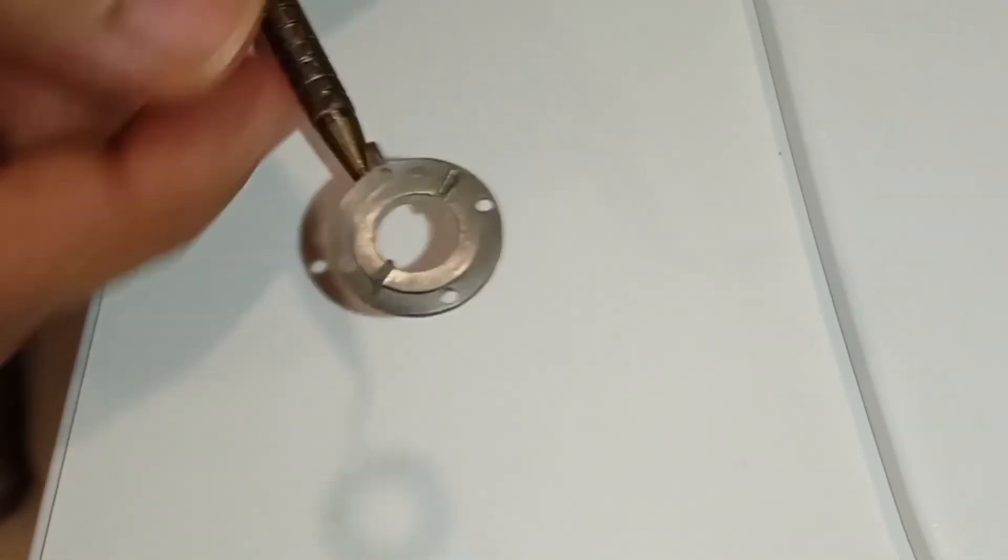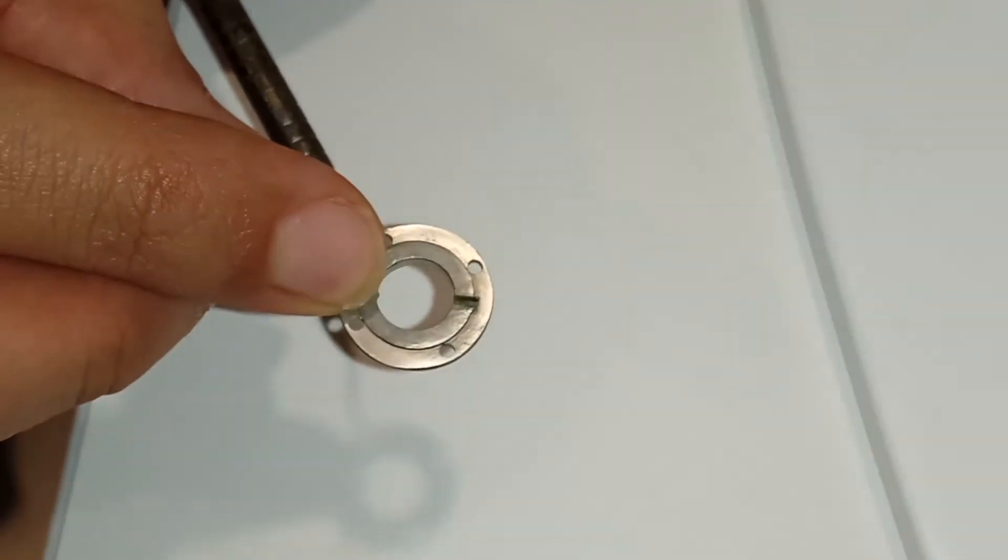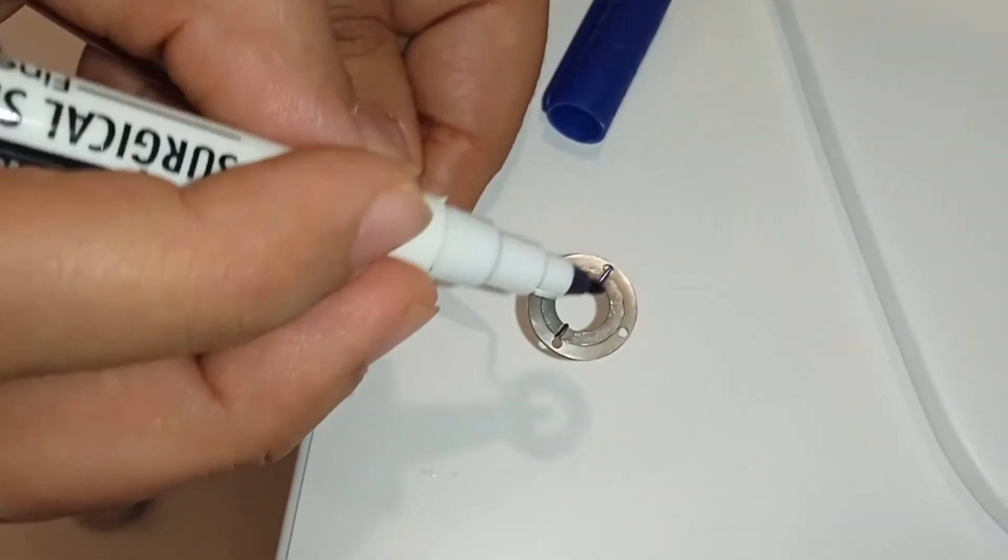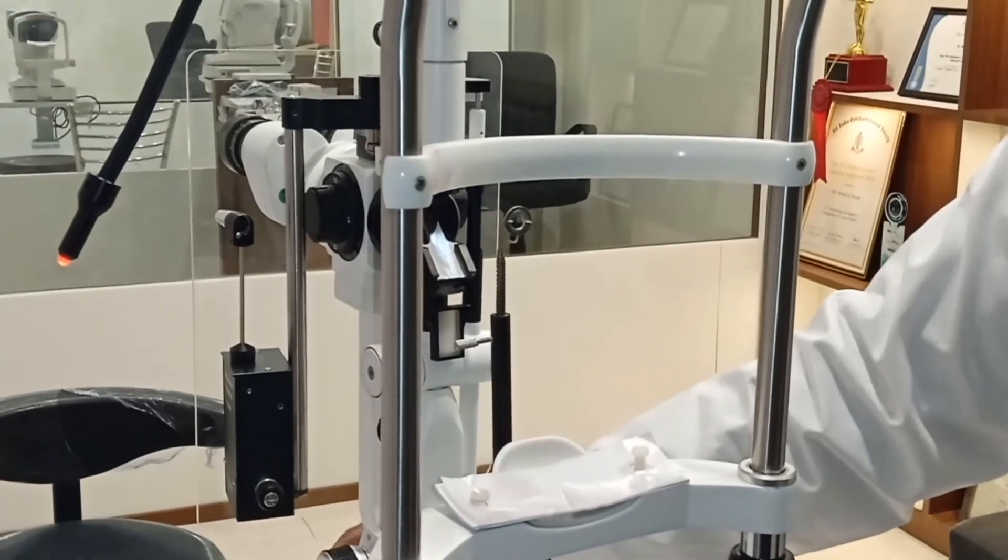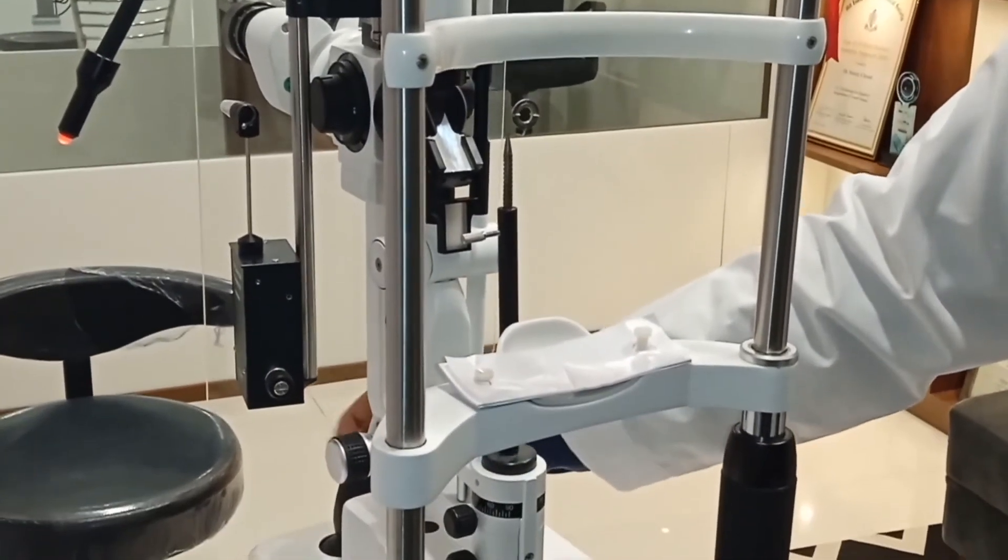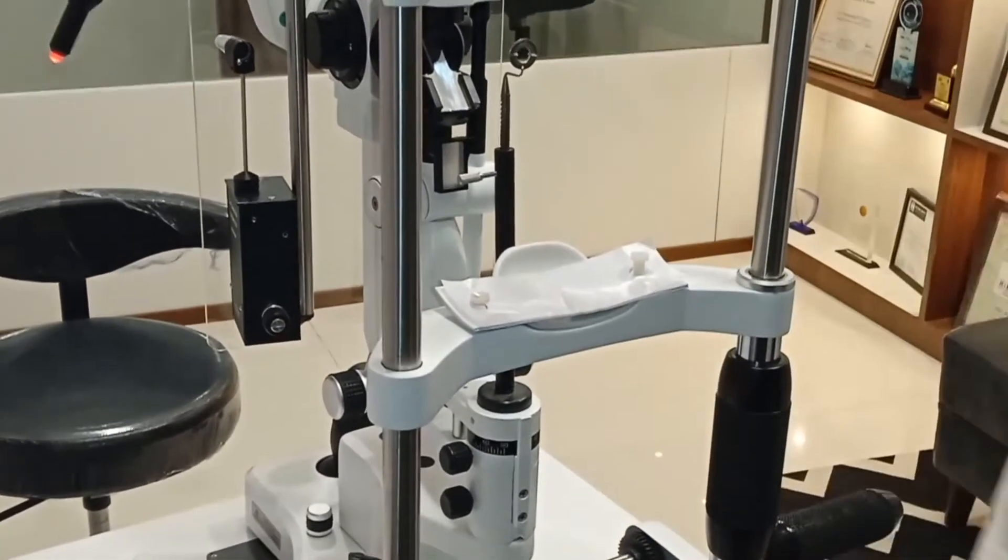We can actually mark the preoperative desirable axis using a blue marker pen, and then it can be fixed again on the calibration slot. The slit lamp can be taken forward, upward, downward, and backward.